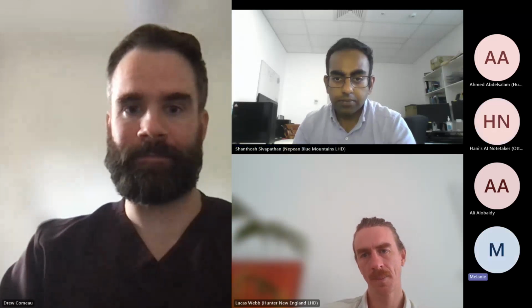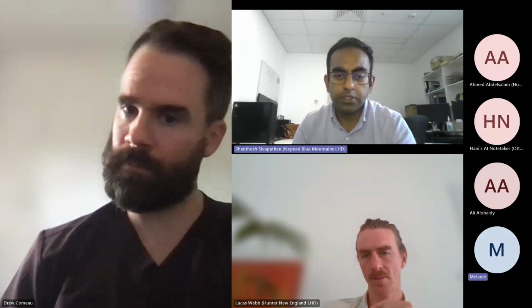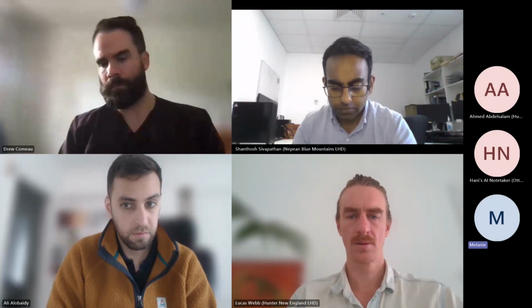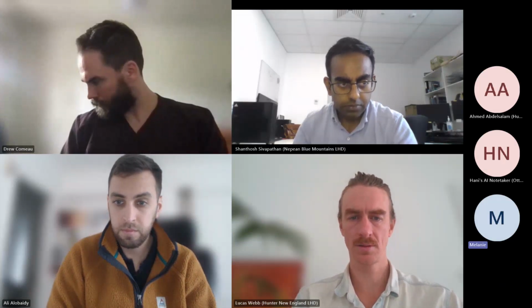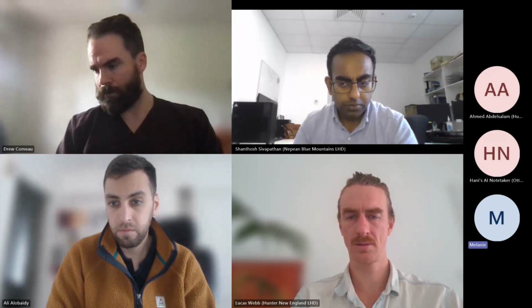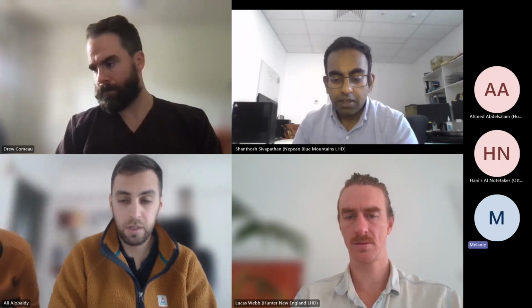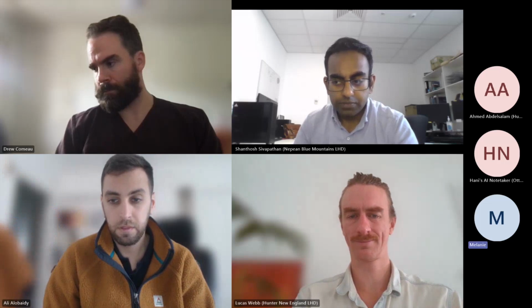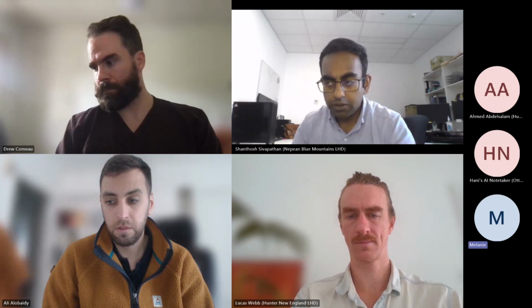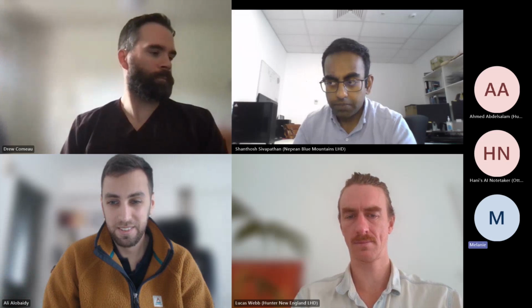I'm sorry, can you hear me? Yeah, absolutely. Sorry, my camera isn't working. I was just wondering with the VSD and the Qp:Qs, because it's an intracardiac shunt, right, should there be less flow going through the pulmonary valve, because some of the flow has gone to the LV? So there's more flow from the pulmonary valve VTI than the LVOT VTI. Would that still make sense if it's an intracardiac shunt?